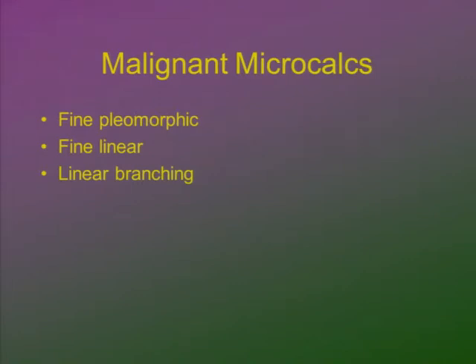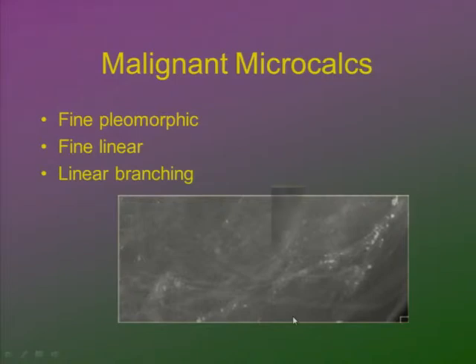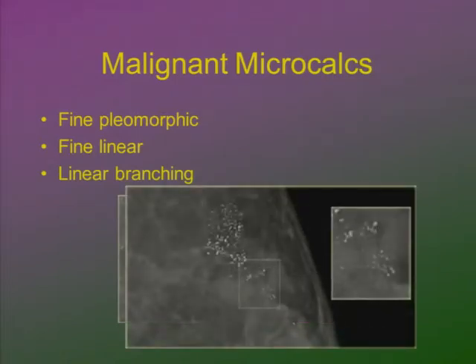Malignant microcalcifications are mostly identified by their morphology: fine pleomorphic (very small with varying shapes), fine in a linear distribution, or branching following the tracks of the ducts — these are probably malignant. You can see fine, small calcifications that are slightly clustered and follow the tract of the duct. Branching calcifications follow the anatomy of the duct.